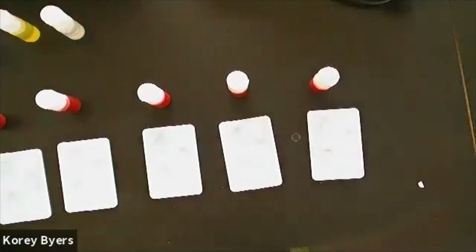Our toothpicks are color-coded. In between samples, we'll want to wipe them off so that we don't cross-contaminate. They labeled the blue toothpick for anti-A, the yellow for anti-B, and the white one for anti-D. That's so we don't accidentally cross-contaminate and mix up our results.